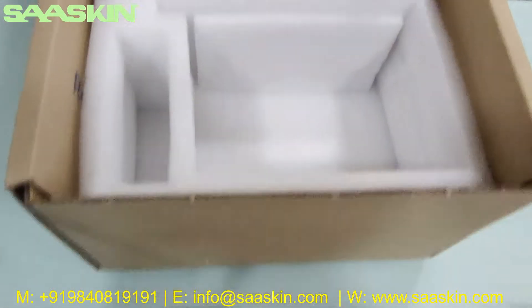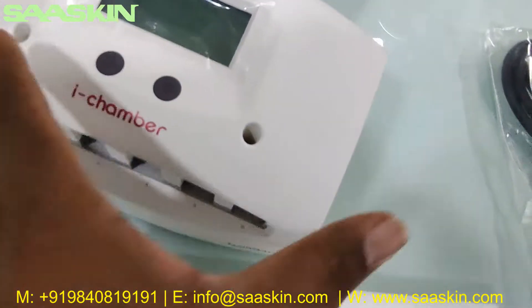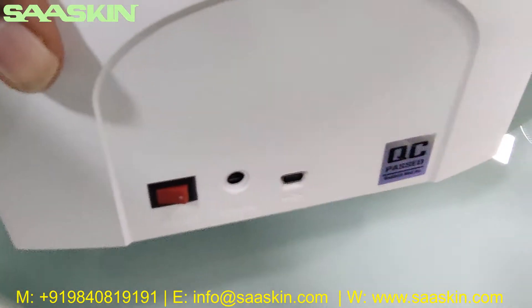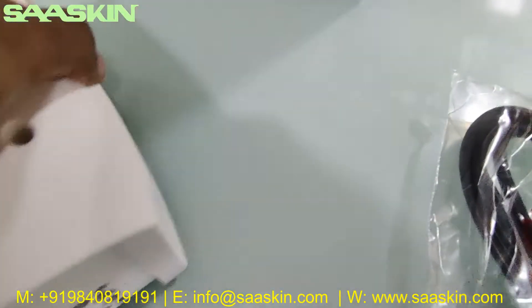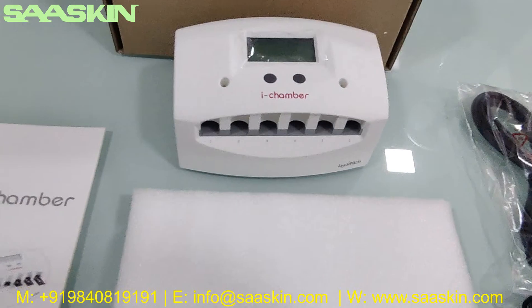These are what the empty box looks like. This is the chamber machine — you can see that. This is the other side of the machine. This is what the machine looks like.